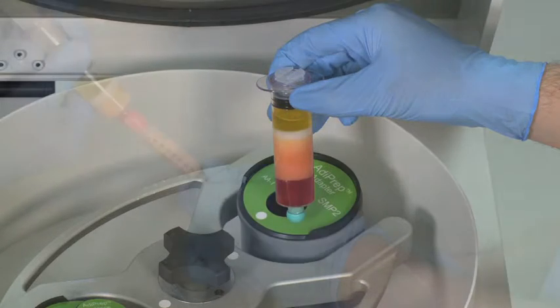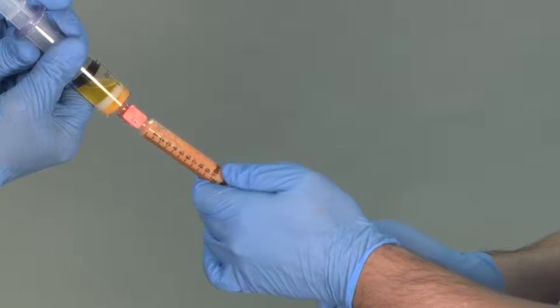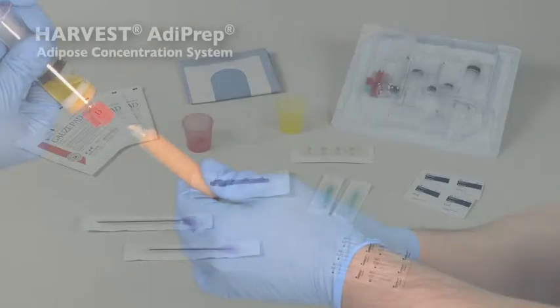Recent studies indicate that refinement of lipoaspirate prior to implantation may promote graft retention, leading to improved clinical reproducibility and better aesthetic outcomes.